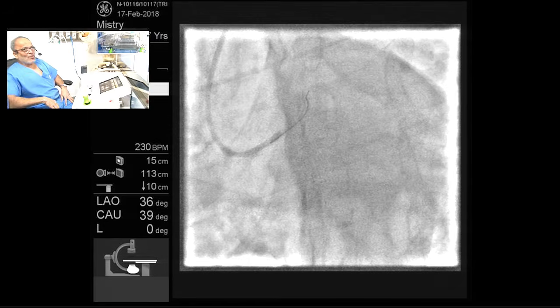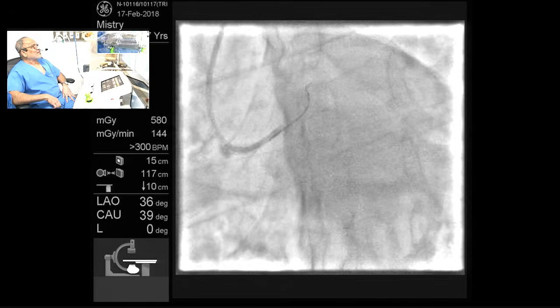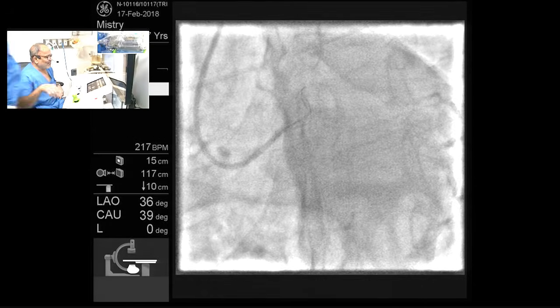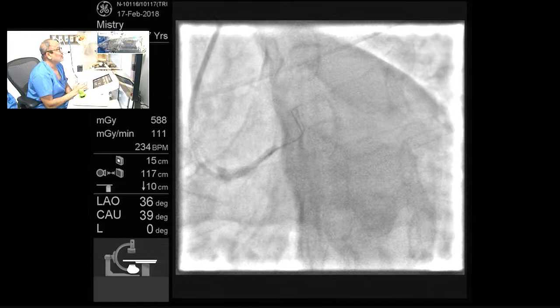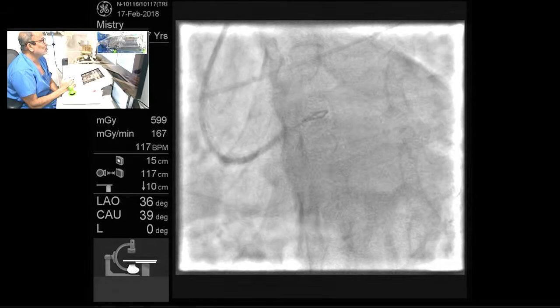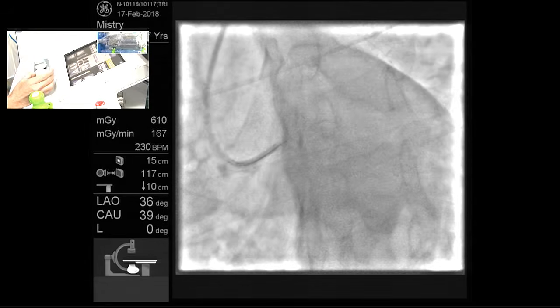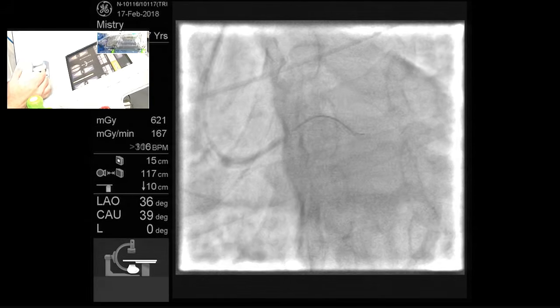You saw what I did. I went deep in the circumflex and all the time I did a counterclockwise rotation to the wire to enter. Oh no. Now it will go. This is a stupid mistake. Anyways, again, the same maneuver.